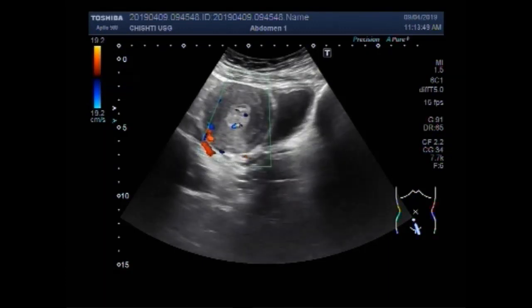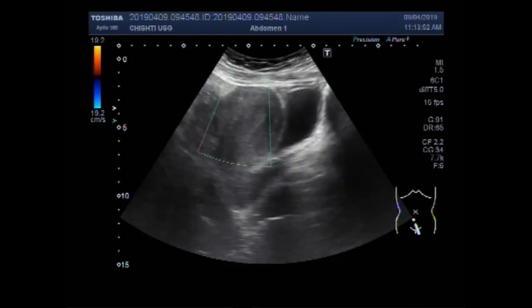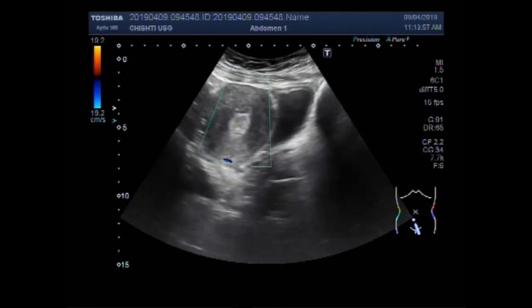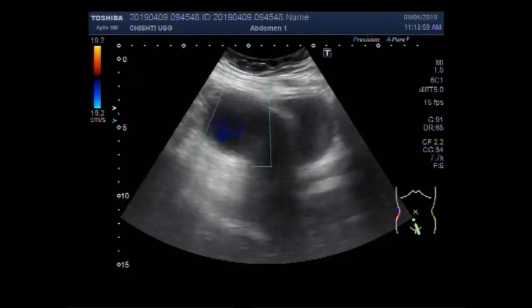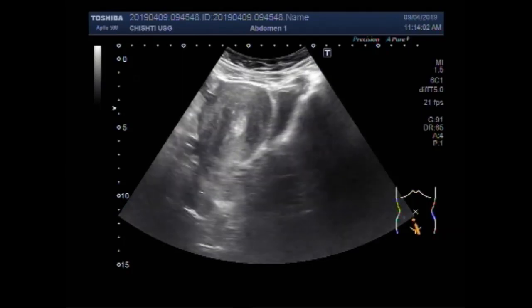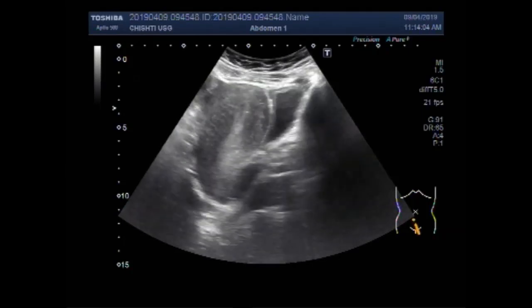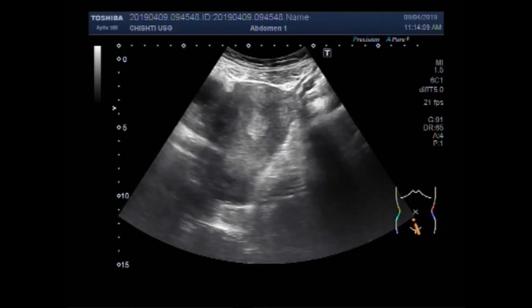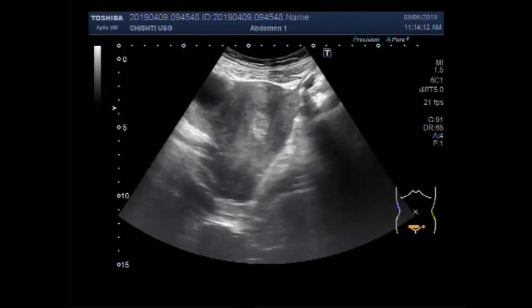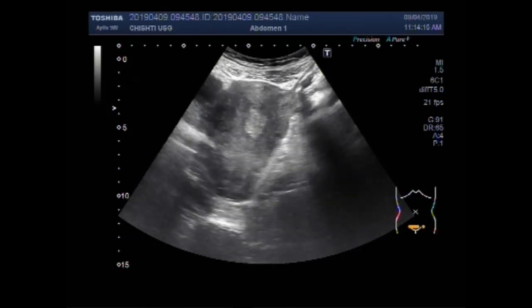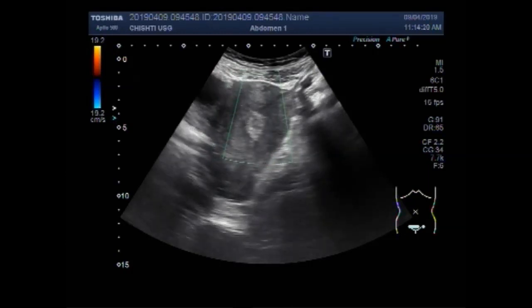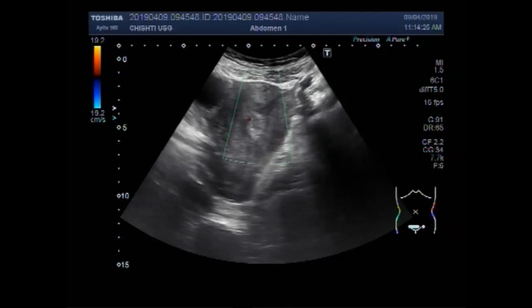You can see the blood flow in the mass. Again, you can see blood flow in the mass — quite a significant blood flow is visible.